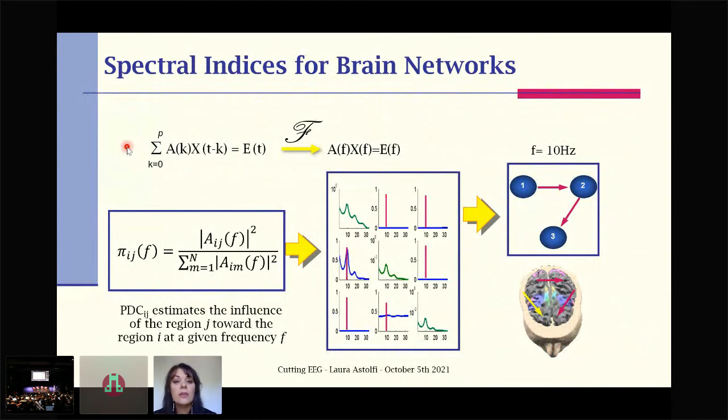We have the Granger test in the time domain. We have the linear, nonlinear, parametric, non-parametric versions. In the frequency domain, we have many estimators based on this basic assumption. So I won't go into details, but the general idea is that we are looking for the temporal precedence between the signals. And so the way in which they are correlated affects this estimation.